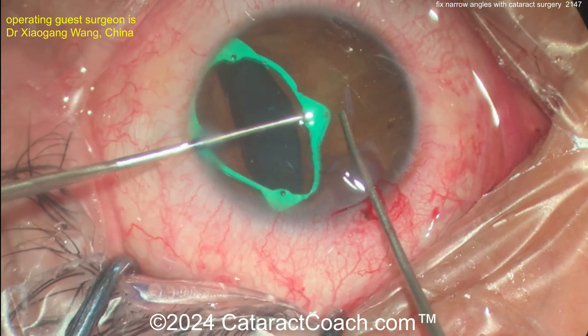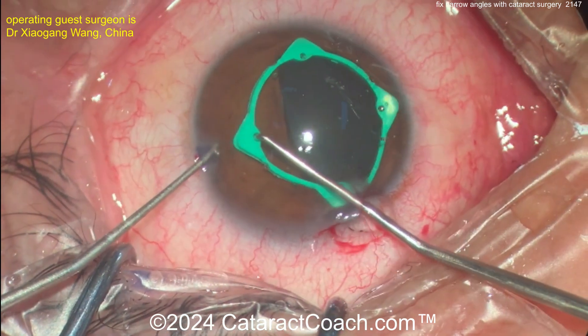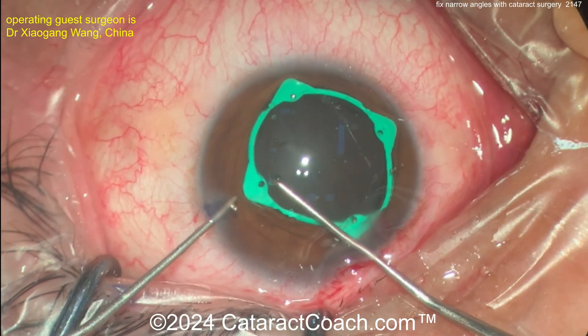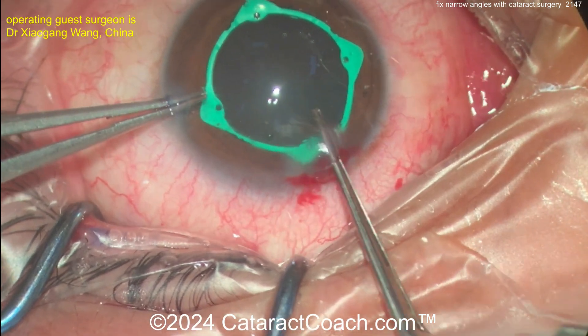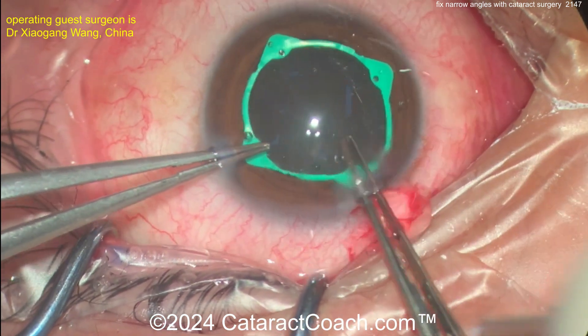All four eyelets are being placed — just be careful with all that iris manipulation that you don't cause any iris damage or even disinsert the iris from the base. Nicely placed. Now you've got a good-sized pupil ring in reasonable position. Let's get that rhexis done.